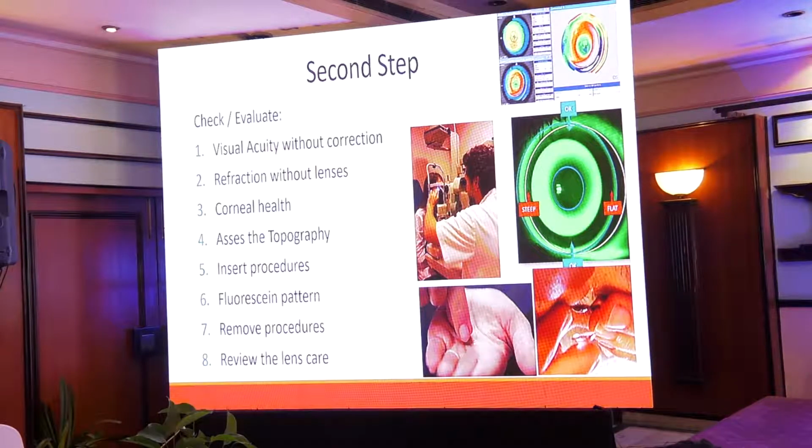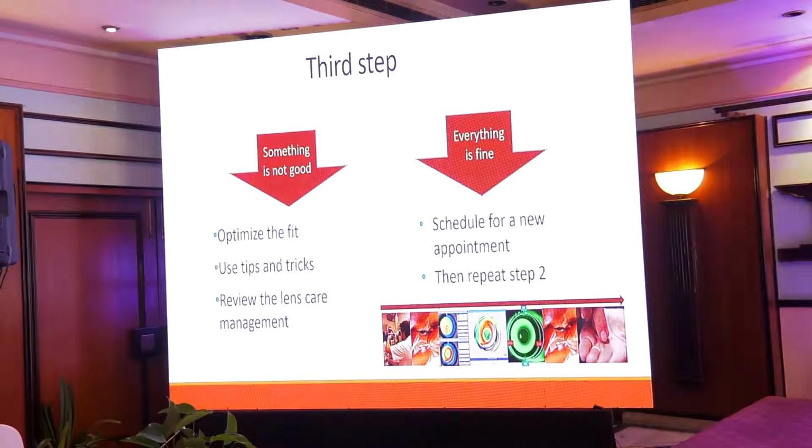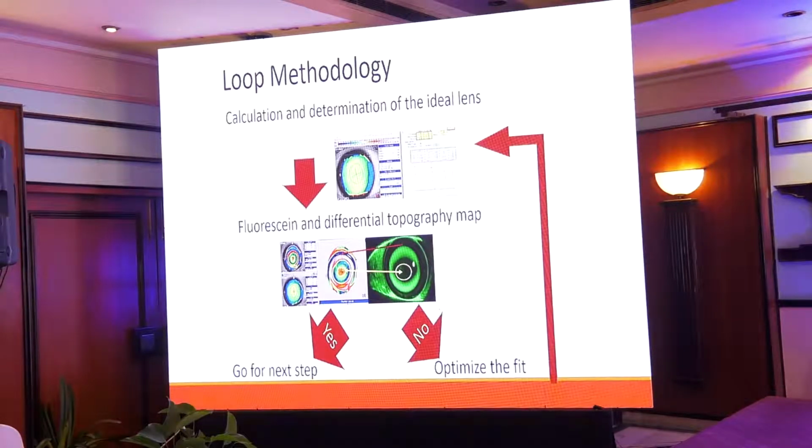One thing we do in every visit is control how the patient puts on and takes out the lens, and how they clean the lens, because that is the main issue: safety. We need to work very well in safety. So this is the schedule, and this is not working so slowly. So basically that's the way we do.